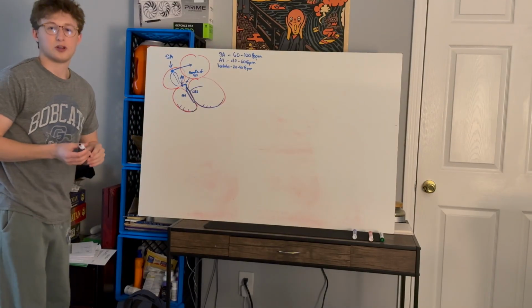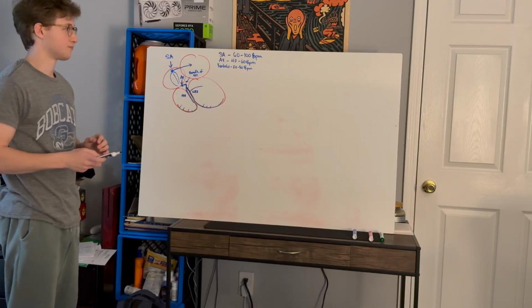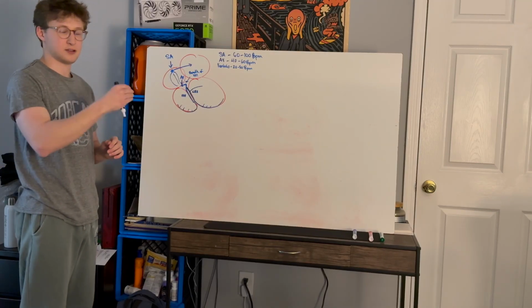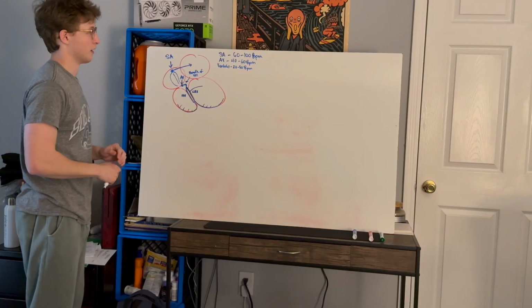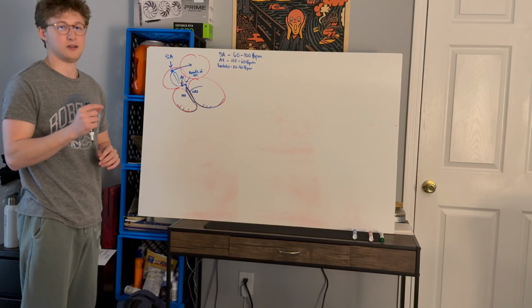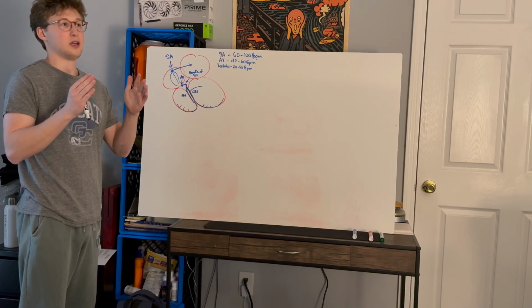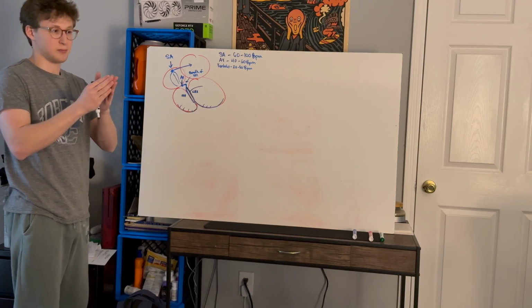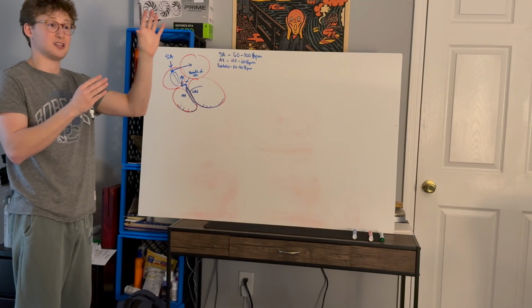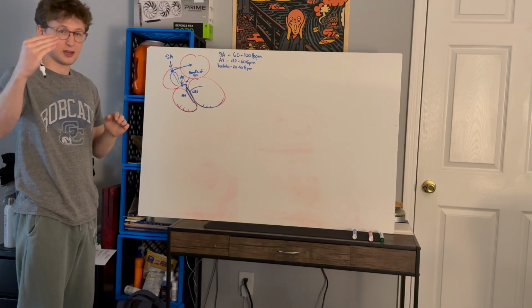So when you're looking at a 12-lead ECG, or even a 5-lead, but we're going to be talking about a 12-lead here, you are actually using 10 electrodes that are placed at different areas of the body. I'm not really going to focus on that right now, but 10 electrodes create 12 leads. A lead is just a viewpoint of the heart. In other words, it is a unique angle in which the machine is viewing changes in electrical activity, changes in voltage in the heart through the skin. So each lead is getting a different view.